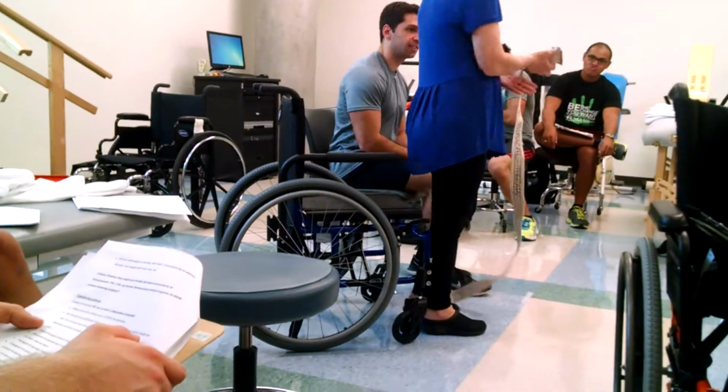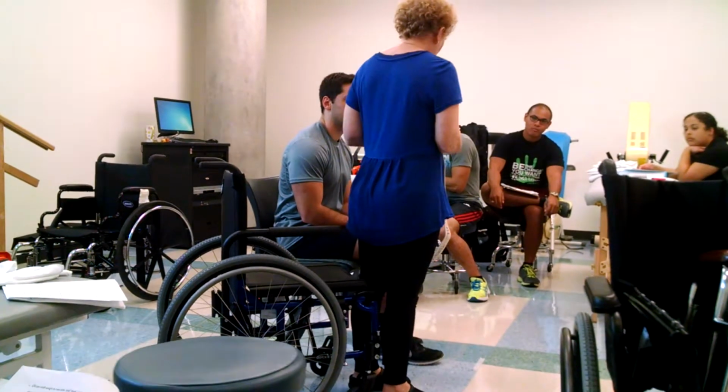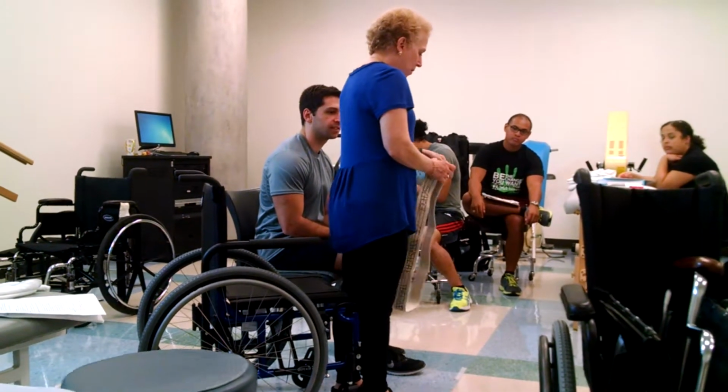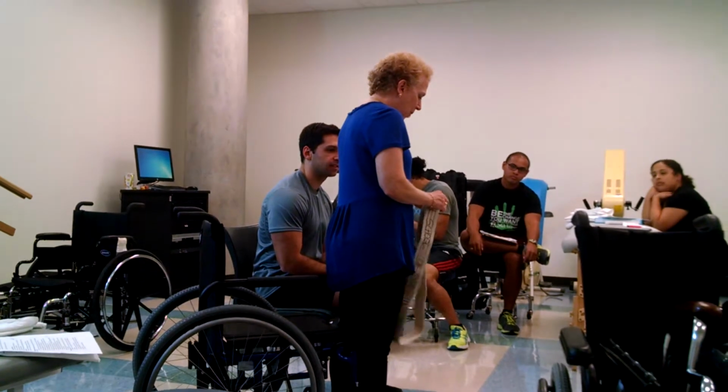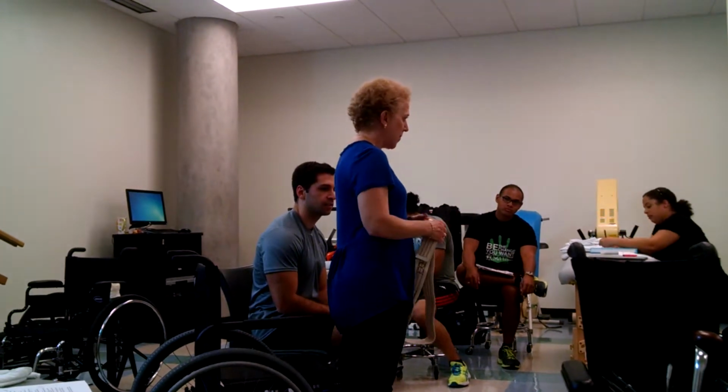Notice when you go to put the gait belt on, notice that there's teeth here. Okay? You put through the side with the teeth first, and then the smooth side. Okay? And you pull it tight.